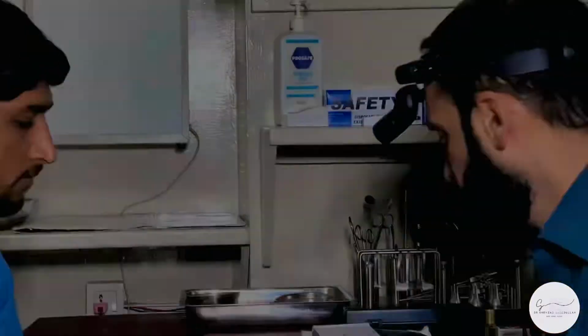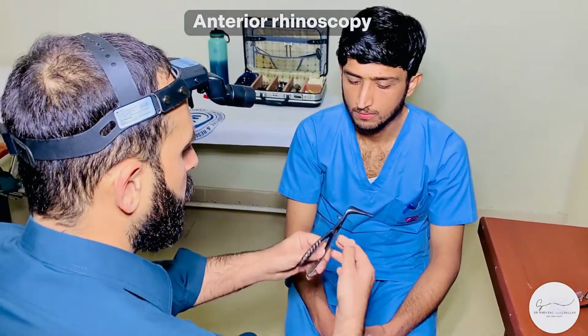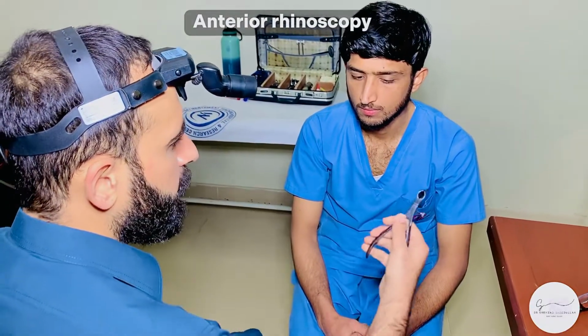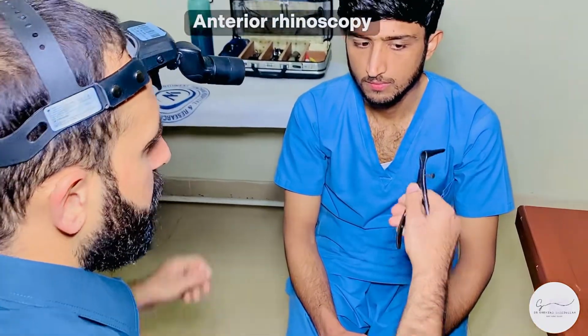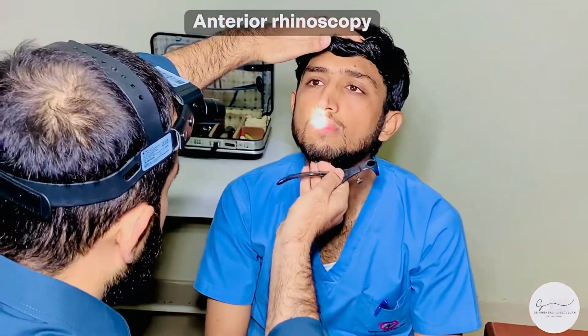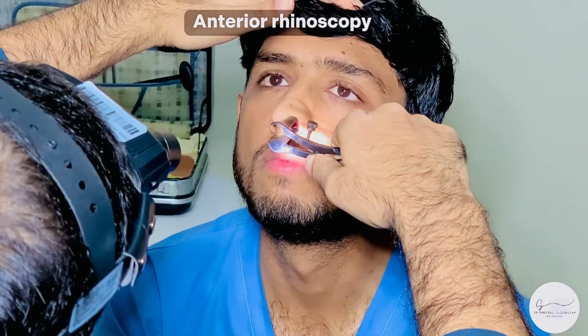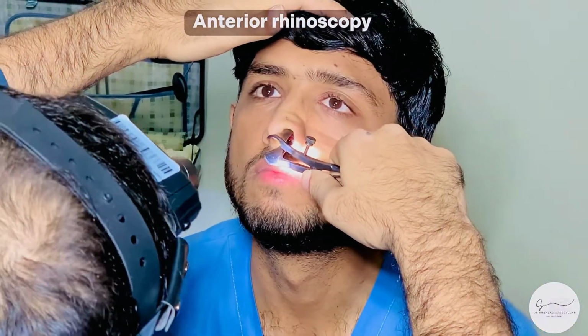So this shows that the nasal patency is normal. After assessing the nasal patency, we are going to do anterior rhinoscopy. In order to do anterior rhinoscopy, we take a Killian nasal speculum. The way that we hold it is like this, right? We will stabilize the head with our non-dominant hand, lift the head up, and gently introduce it inside the nose and have a look at the structures that you can see.